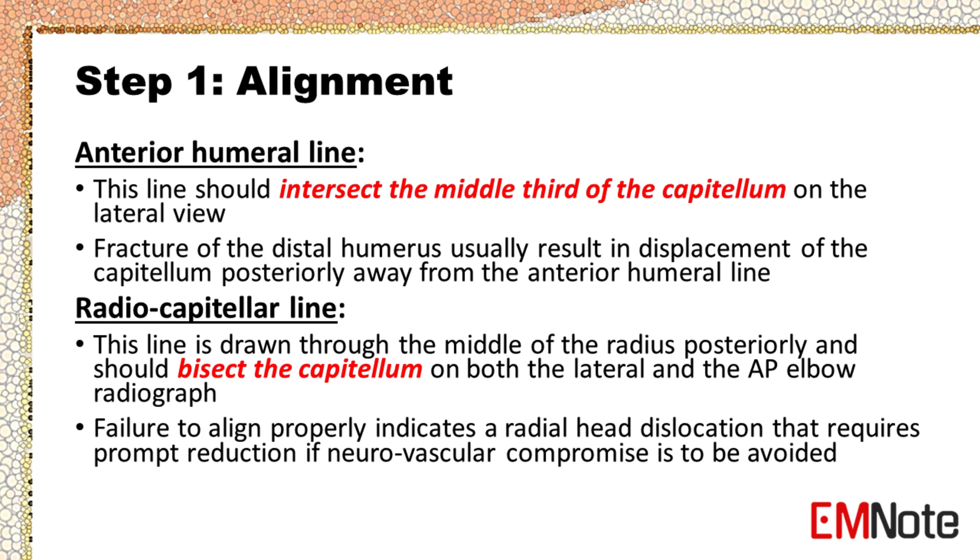Step 1 — Alignment. Check the anterior humeral line and the radiocapitellar line. The anterior humeral line should intersect the middle third of the capitellum on the lateral view. Fractures usually result in displacement of the capitellum posteriorly away from the anterior humeral line.